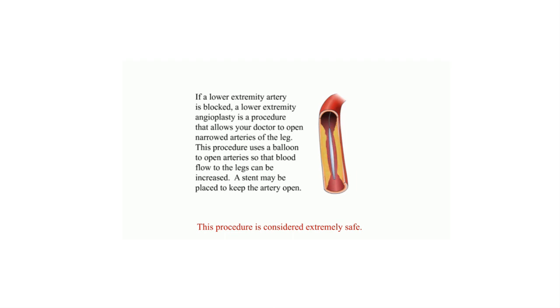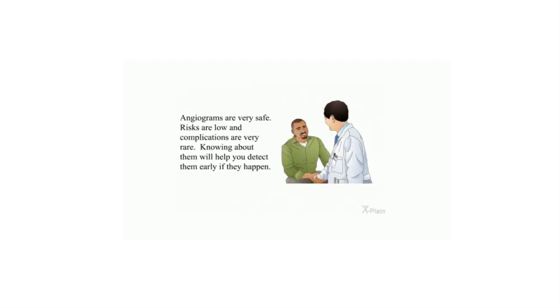This procedure uses a balloon to open arteries so that blood flow to the legs can be increased. A stent may be placed to keep the artery open. Angiograms are very safe. Risks are low and complications are very rare. Knowing about them will help you detect them early if they happen.